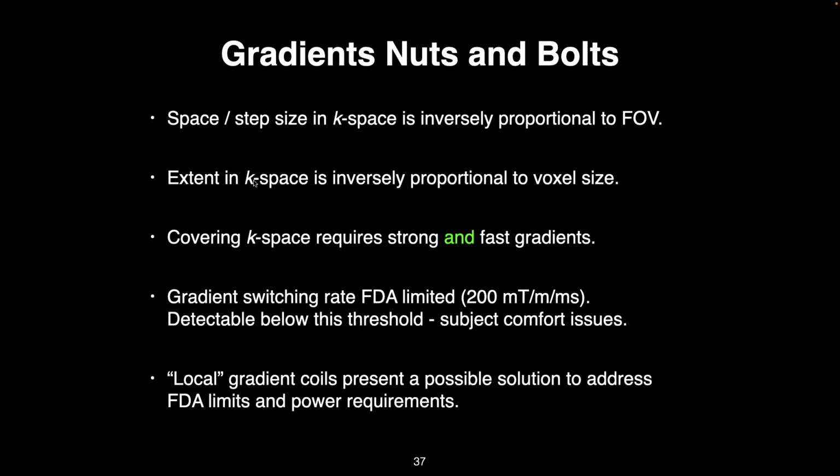The next point is how far out you go in K-space. So remember from that example of President Lincoln, if we don't go very far out, if we just get information right around the middle, very blurry. And that affects essentially your experiment's resolution. So if you want to get higher resolution data, you need to acquire more K-space. You need to go further out in your K-space extent.